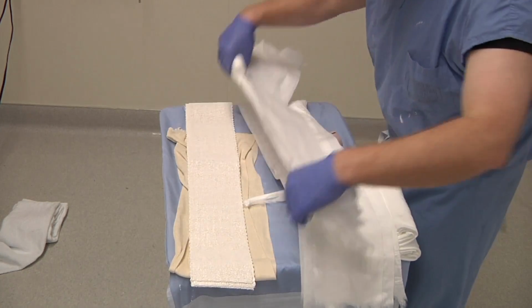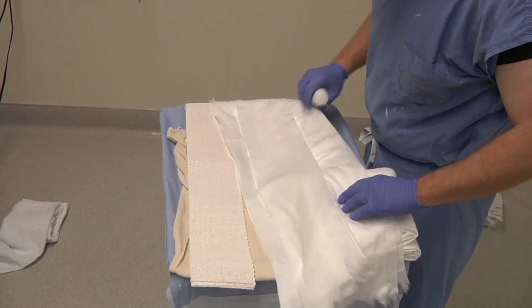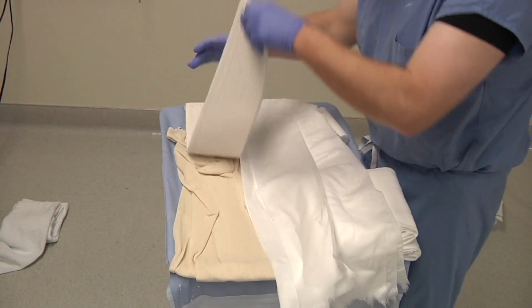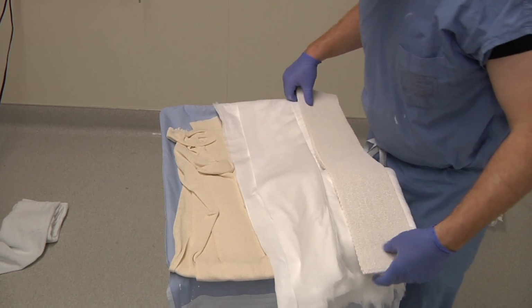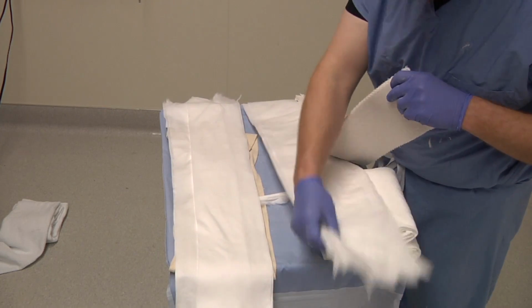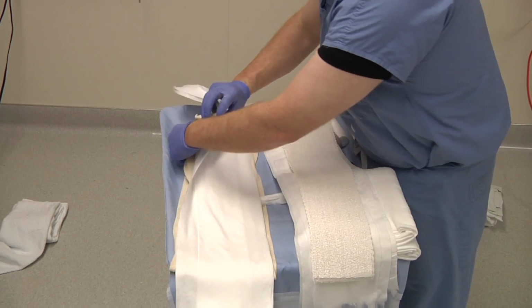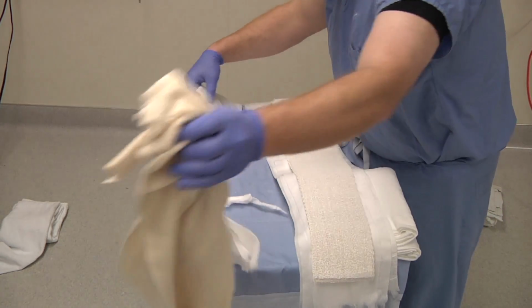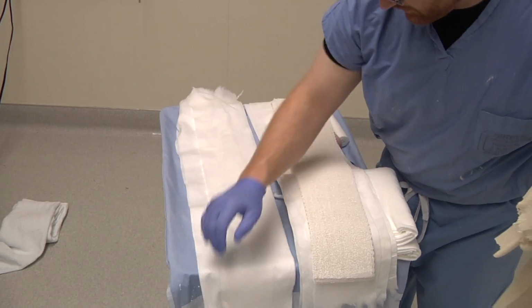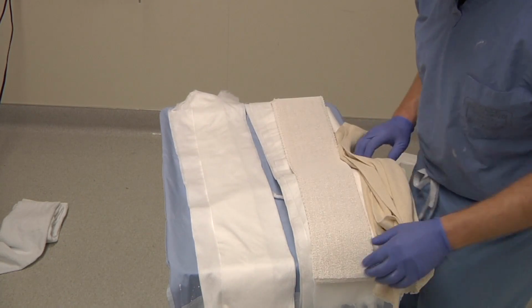So now, as you can see, we have two multi-layer cotton web rolls. Next, what we do is lay them out to make a sandwich, and also prepare our long strand of tubular bias. So we'll be placing these inside. Have that ready.